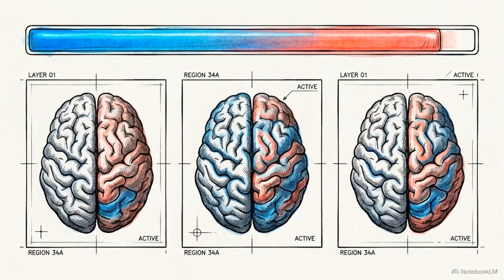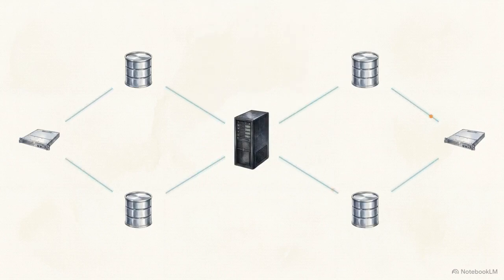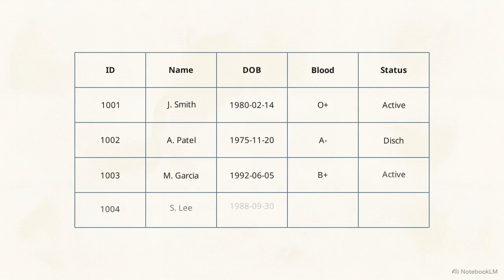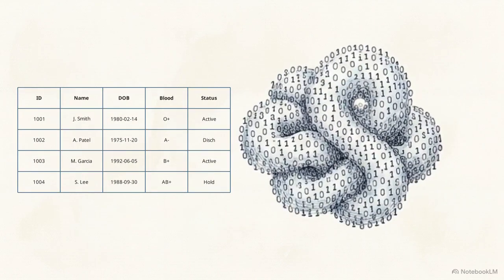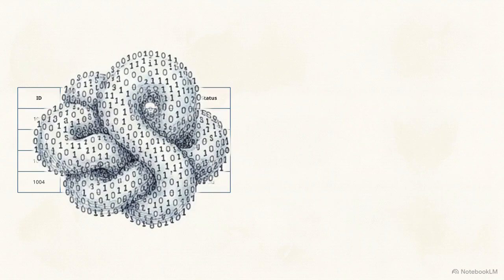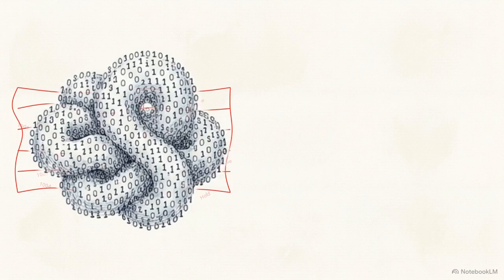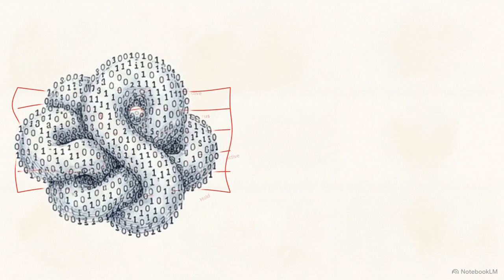While the interface displays results in seconds, the request triggers a complex series of operations within the underlying database architecture. A standard Relational Database Management System, or RDBMS, is optimized for one-dimensional alphanumeric strings. It organizes highly structured data into predictable rows and columns. A 3D MRI scan is a massive, unstructured binary multimedia object. These files lack the clear markers and consistent lengths that relational databases require for efficient processing.